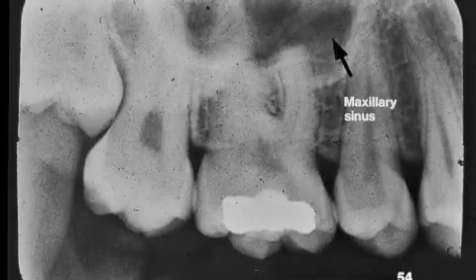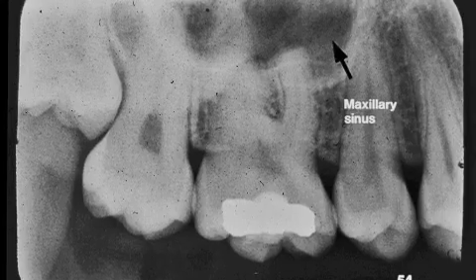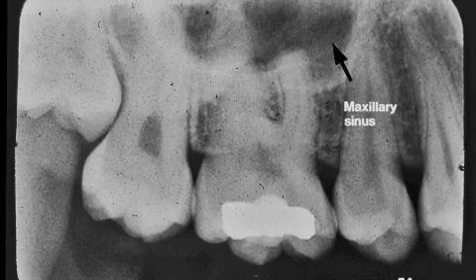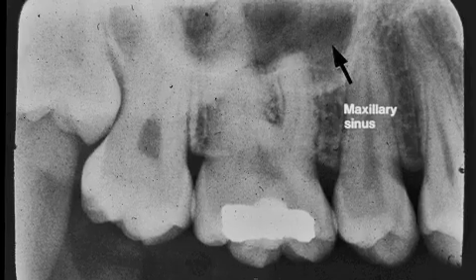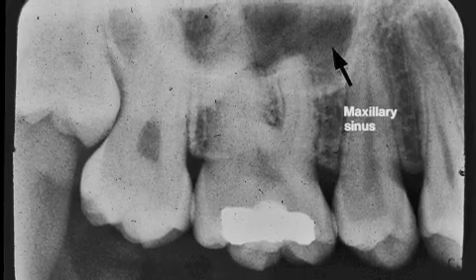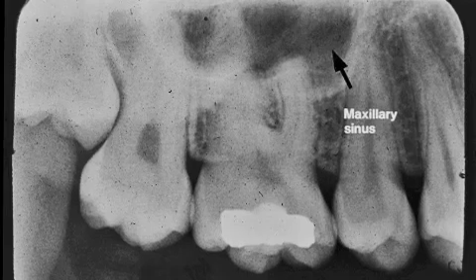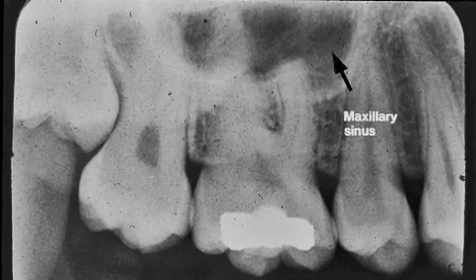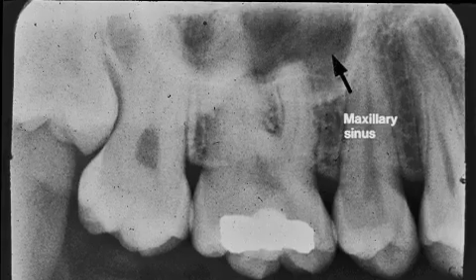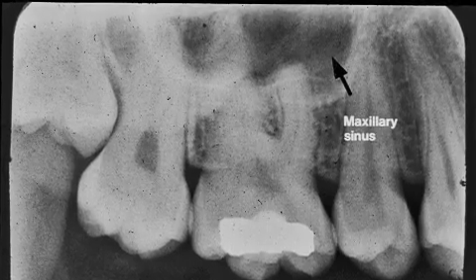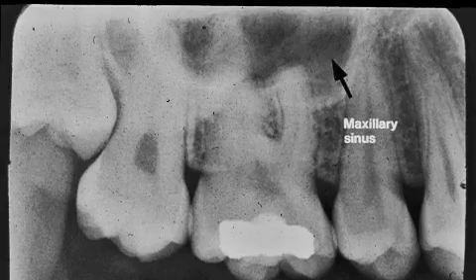The arrow points to the radiolucent maxillary sinus. The sinus extends from the distal of the canine posteriorly. It is a large radiolucent area outlined by cortical bone, and that cortical bone is radiopaque and forms the floor of the sinus.